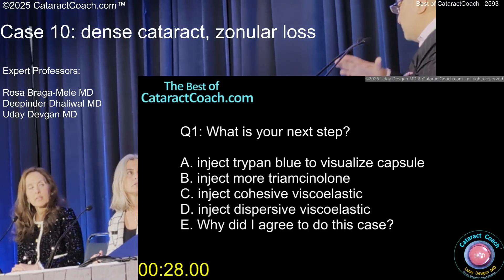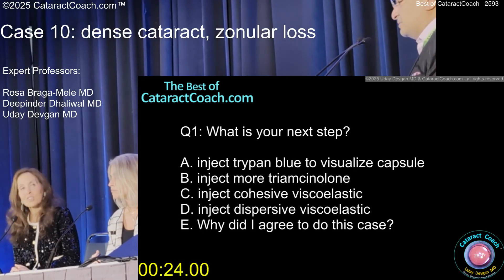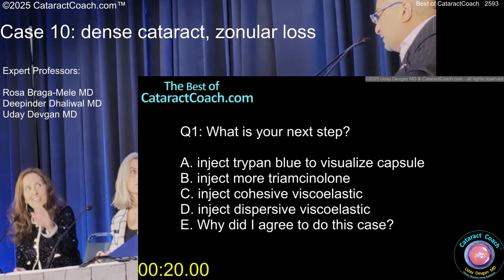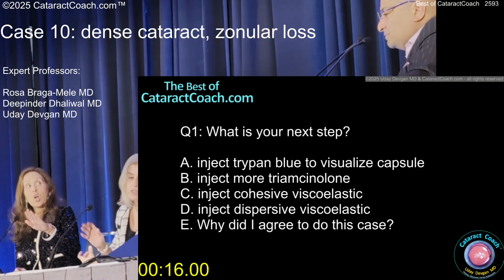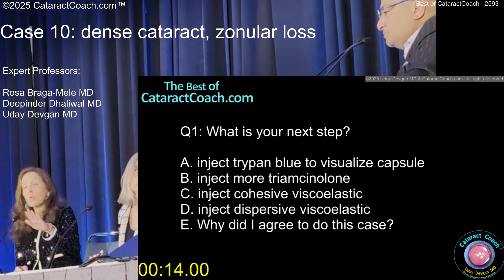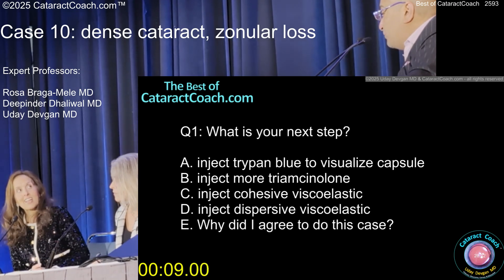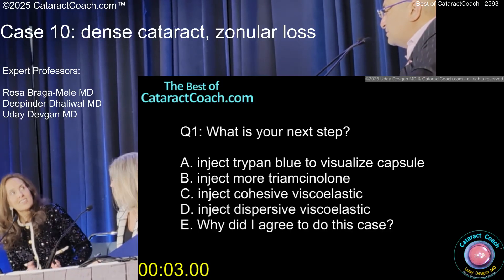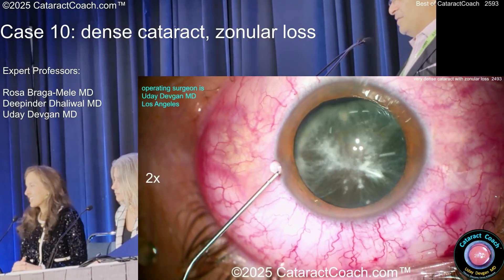Do you prefer a soft shell or just dispersive? Just dispersive — I do dispersive too. Then paint the capsule with trypan, just a little bit, because if there are obviously zonular issues you don't want to stain the vitreous. I paint the capsule but leave it a little bit longer if I want a deeper stain. Are you not worried it makes the capsule more fragile? Not that long — just about 30 seconds.